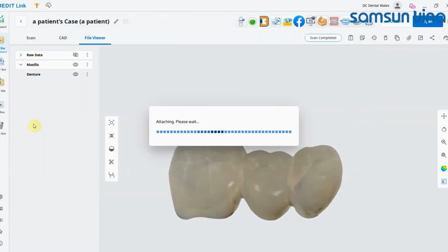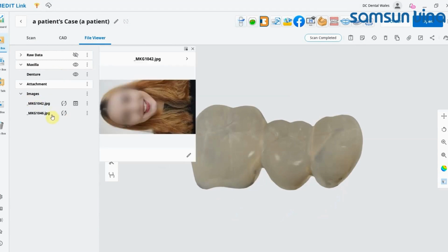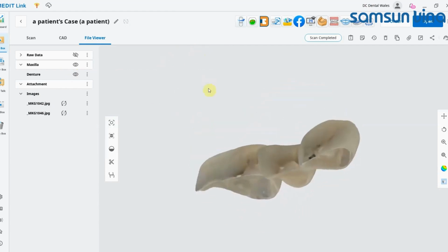And you'll see in the file viewer list on the left hand side, you'll see them appear there in just a moment. So you could do this with radiographs or CT scan images. And there are our photos attached, and then we could run the smile design if we wanted to, or we can just keep it as a record to go with that case for posterity.